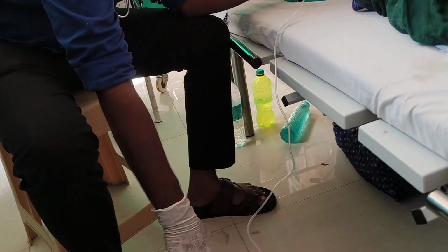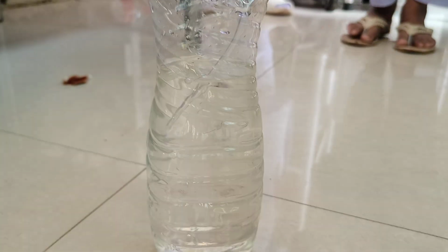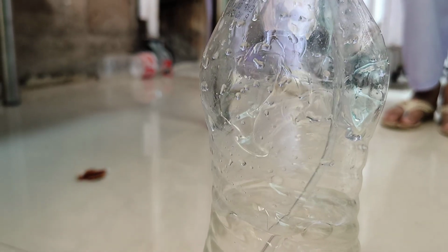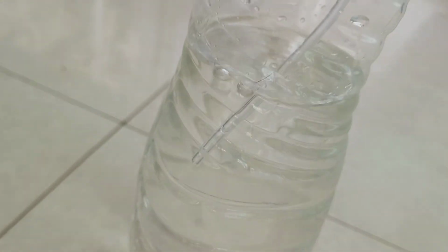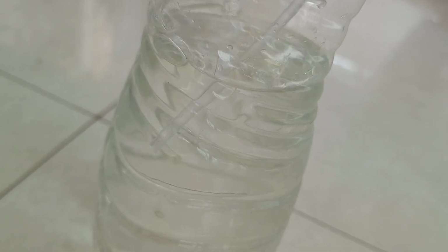See, you can see this. Yes, right. You can see the air bubbles. You can see these bubbles coming. One of you come here. Hold here. You can see the bubbles, air bubbles in this water bottle. So this is a procedure of removing the air from the lungs, from the pleural spaces. See how much air is coming.